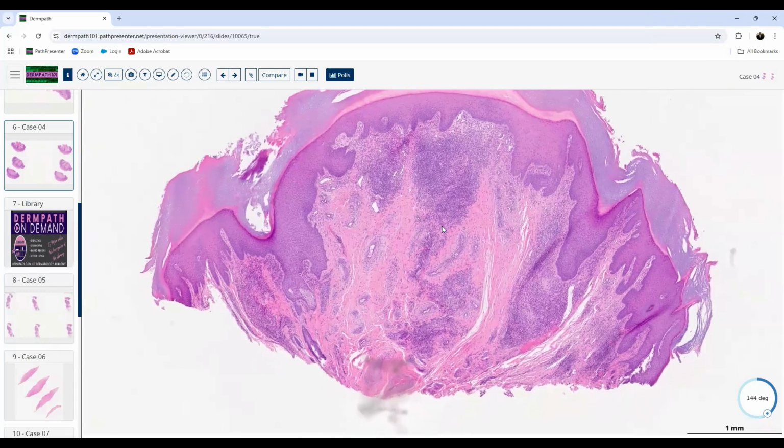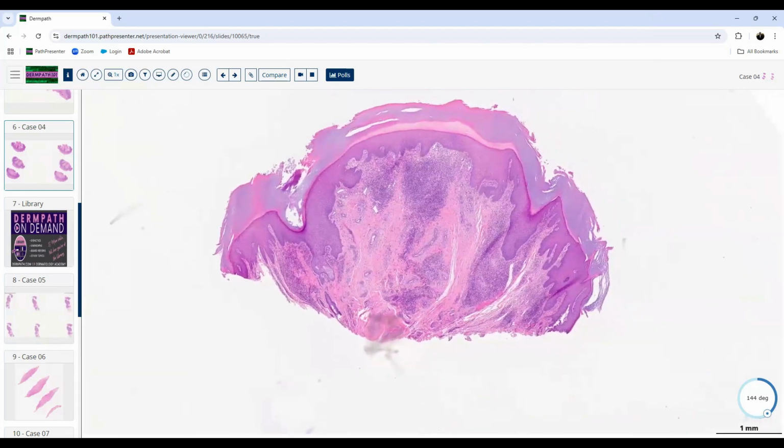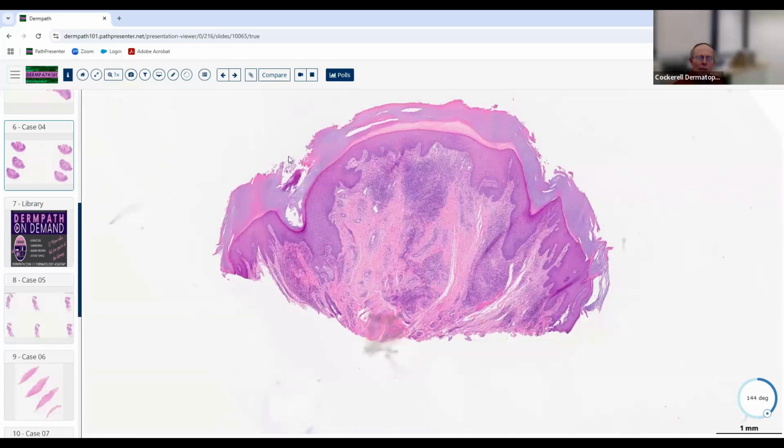Then I noticed a lot of inflammation and some proliferation of vessels. So I was favoring a benign neoplastic process here. Overall it's generally well localized, and the edges are encompassing the lesion. I didn't notice significant atypia. It looks like a little papular lesion that they just shaved the whole thing off. Kind of looks like a wart. Maybe they thought it was a wart.